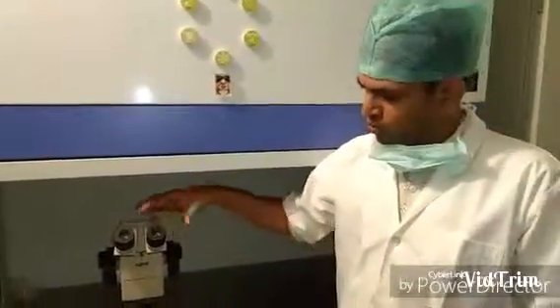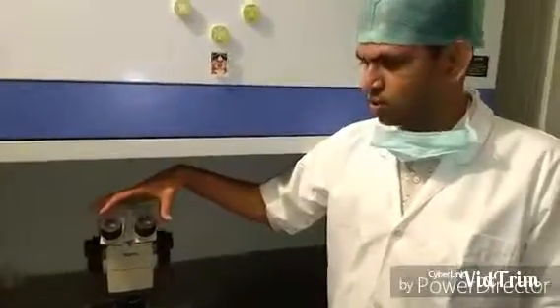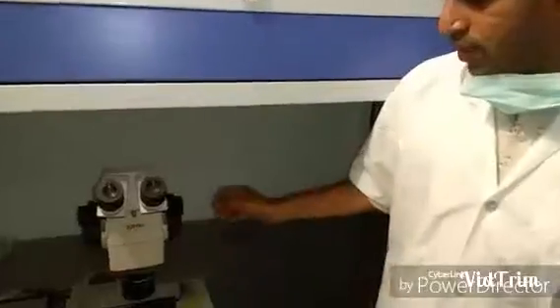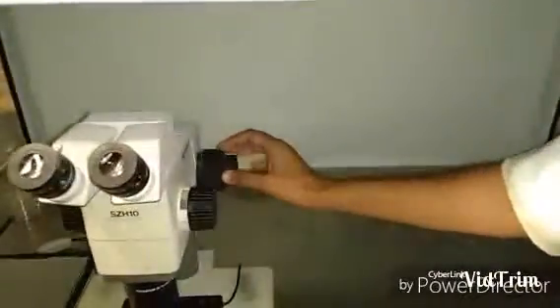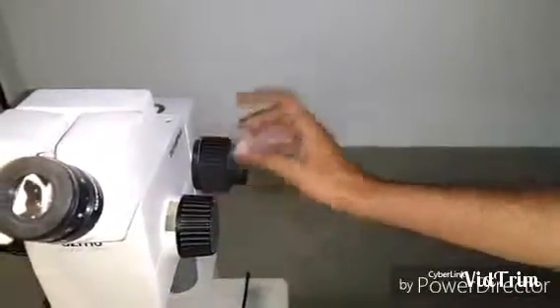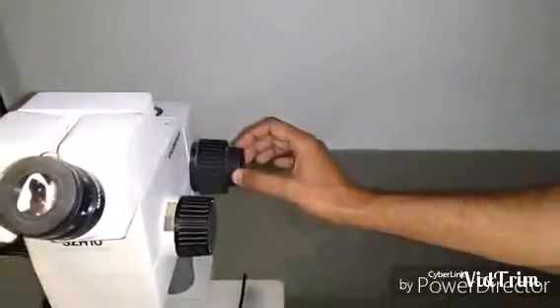The StereoZoom Microscope is a binocular microscope. As you can see it has got two eyepieces. We can adjust the focus using these knobs here. This big knob is for the coarse adjustment and the small one is for the fine adjustment.